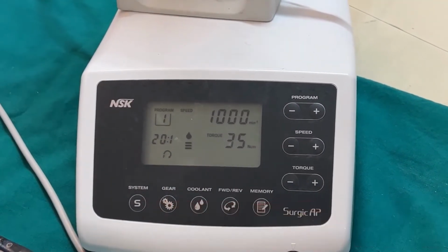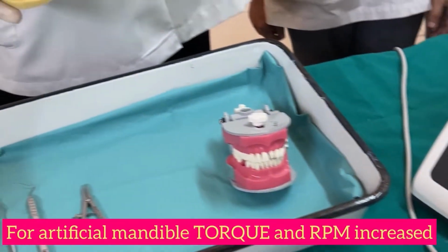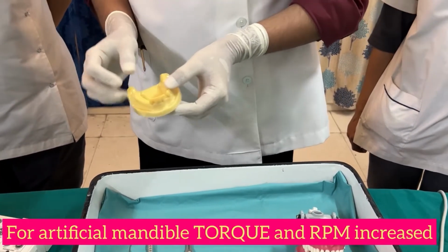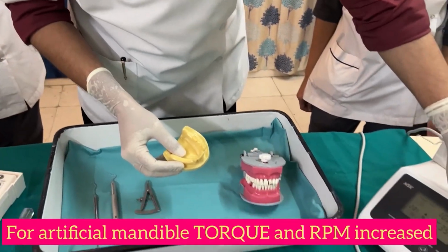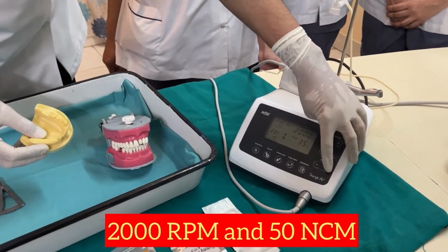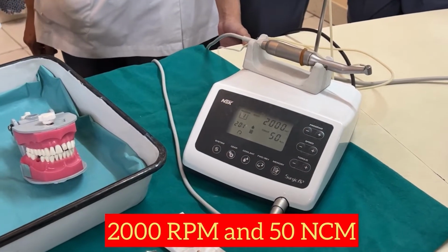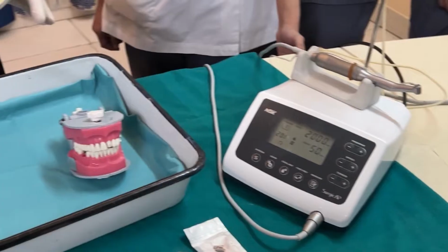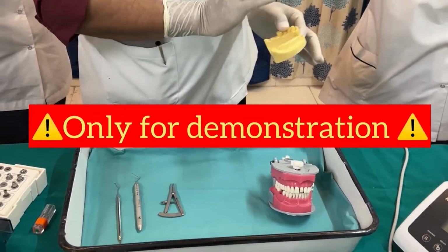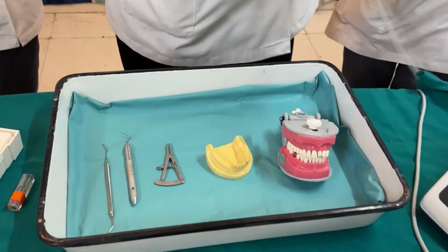Now this is an artificial mandible, so naturally much higher RPM and much higher torque would be required. In this case I will set it at, let's say, 2000 RPM, and the torque I will set to the maximum, 50 Ncm. I am setting this only from a demonstration point of view. This is not what you will be doing in the patient. Is it fine? So let us now begin with the demonstration of the placement.